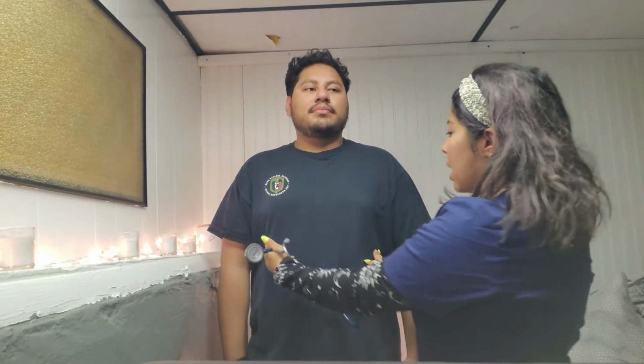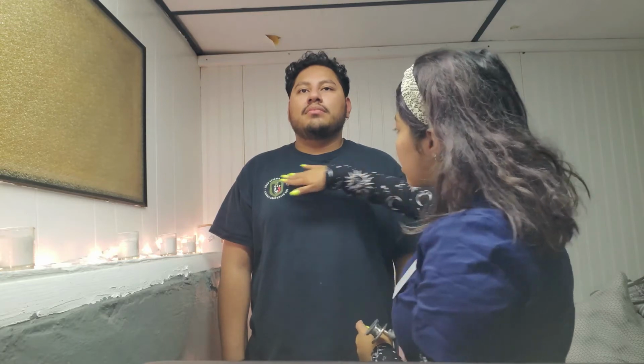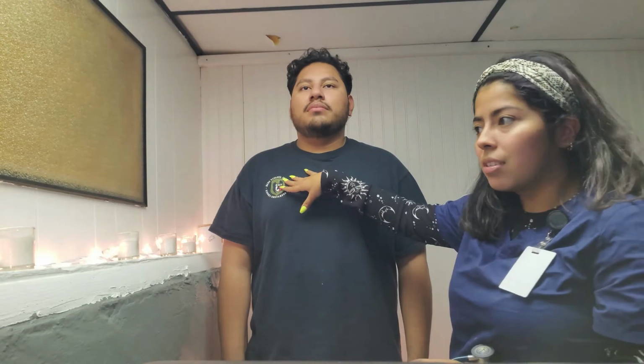For 11 and 12, you have to make sure that it's more towards the side because of the lower lobes, like I said. Each time you go over here, you want to make sure the patient takes a deep breath. But if they have shortness of breath or asthma, this part might be a little difficult for them, so you need to make sure that they have enough time to catch their breath. You want to go in between here and avoid the breast tissue, or else it's going to be hard to hear. Another issue is that you might hear heart sounds, so you have to train your ears to only listen to the lung sounds.